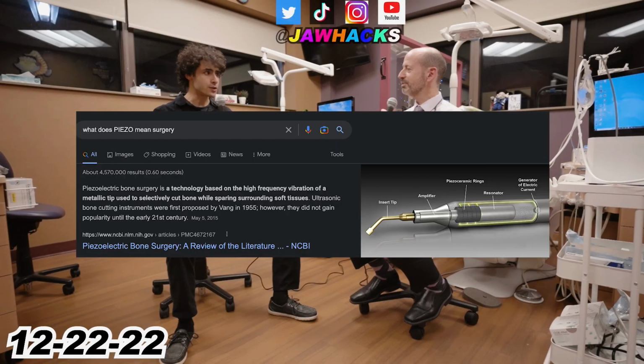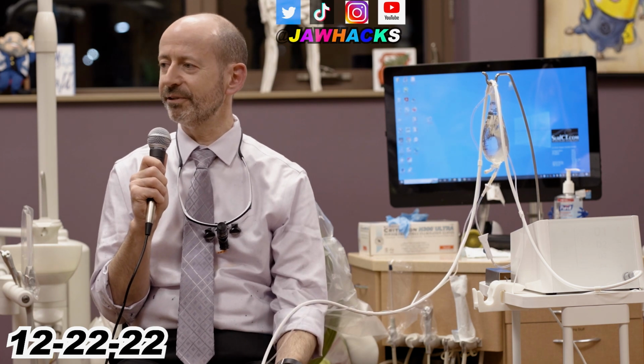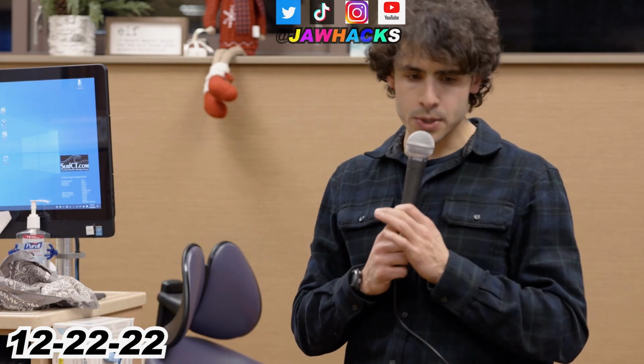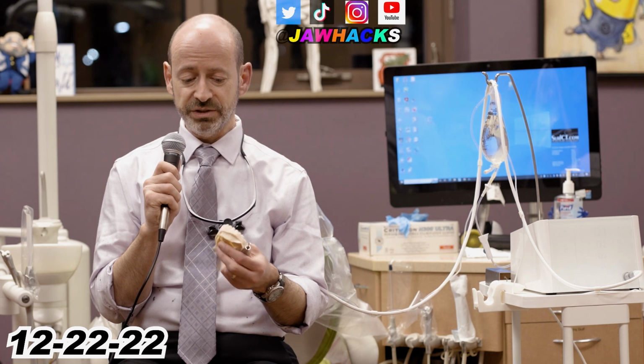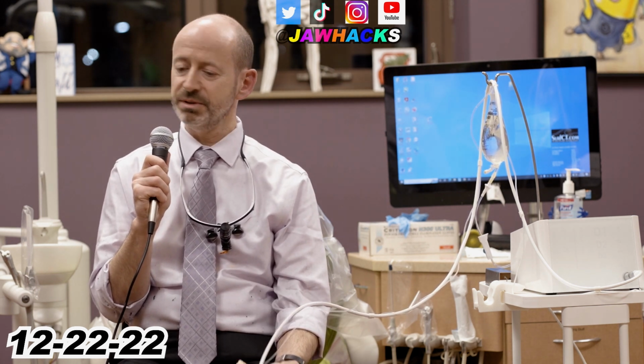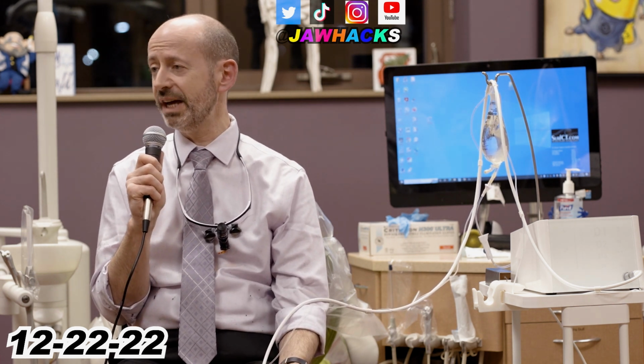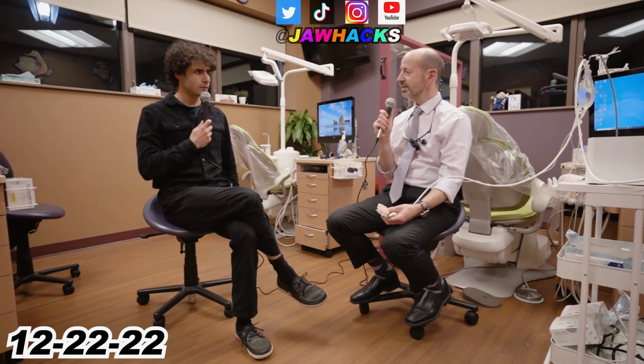PIEZO knife, PIEZO tome. The PIEZO tome is the proper name for it. And what basically does it do, doctor? It is essentially a knife that will cut through the bone and it will cut through the suture, and it will help to loosen up the connection of right and left half in the upper jaw, in the maxilla.